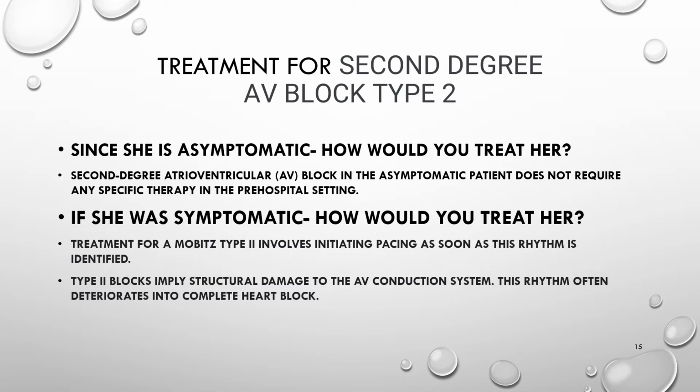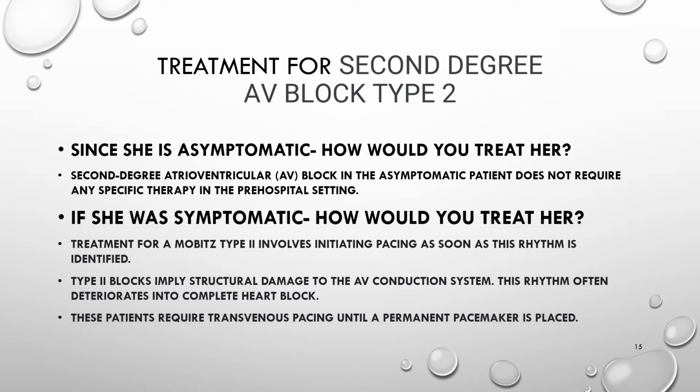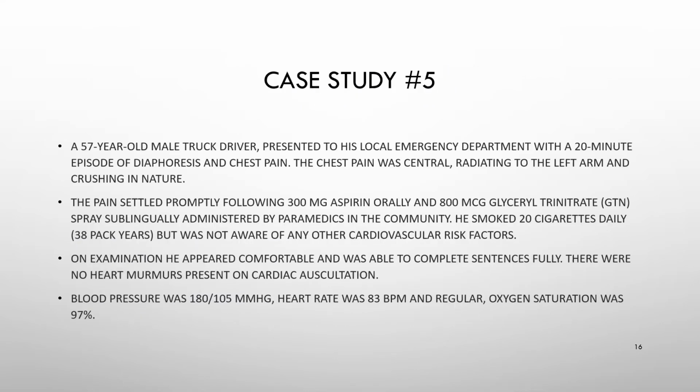Something has got to be done immediately, especially the fact that she is symptomatic. These patients typically require pacing until a pacemaker is placed, and this is the normal treatment process for these. This is our final case study for EKGs.